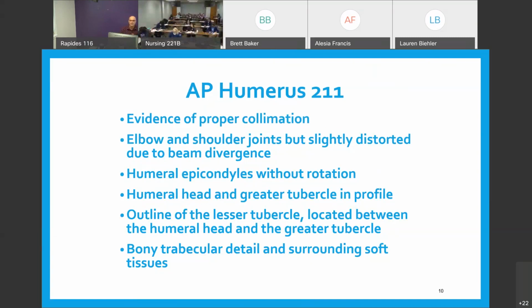Does anybody understand that? Does anybody understand divergence of the beam yet? No, it's okay. Our x-rays come down from a pinpoint, and as they travel, they disperse. They spread out. Just like when you take a flashlight and put it real close to your hand and you pull the flashlight away, what does the light do? It spreads out. It gets bigger, right? That's dispersion. That's what x-rays do.